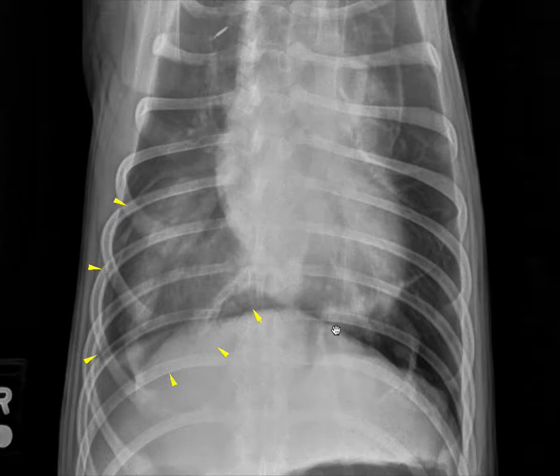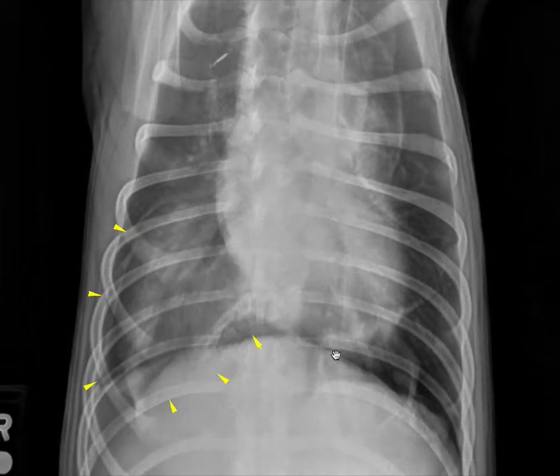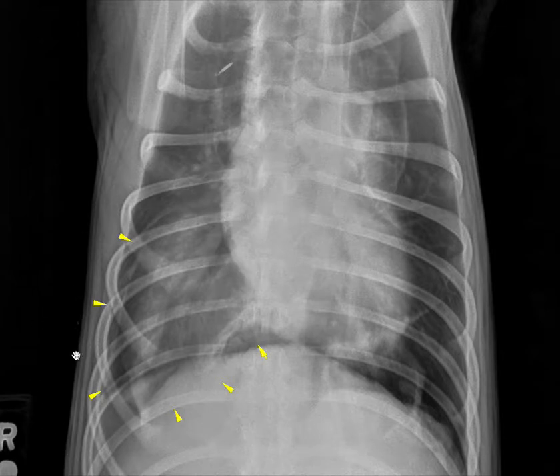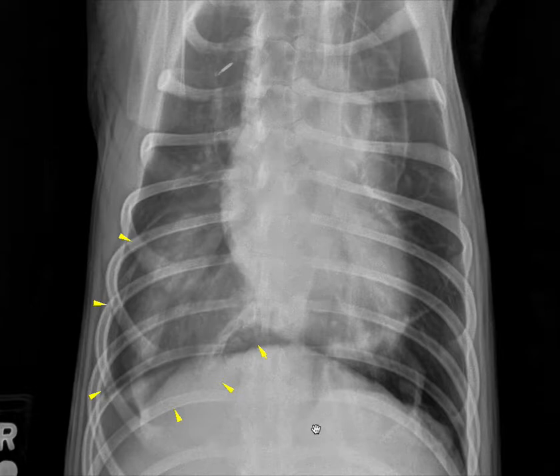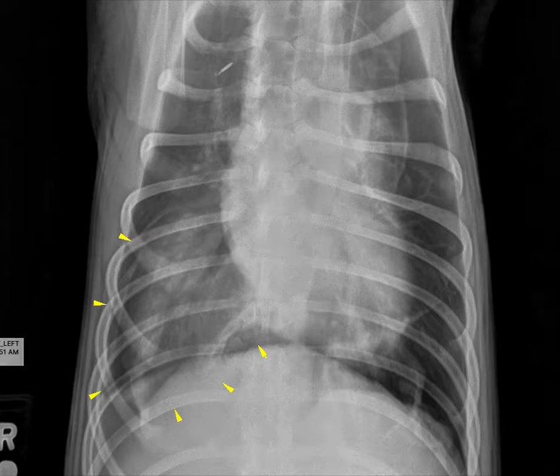What I start by doing — and I'm using the VD view here to show you — is I get a look at which part of the lung is most affected by the pathology that I see, which often comes down to which part of the lung is the most radio-opaque. This VD view is a nice example showing that the most radio-opaque lung lobe, as depicted with yellow arrows, is the right caudal lung lobe. Once I've looked at the area where opacity is increased, we'll then look at two normal anatomic features whose conspicuity will help us decide about the lung pattern.